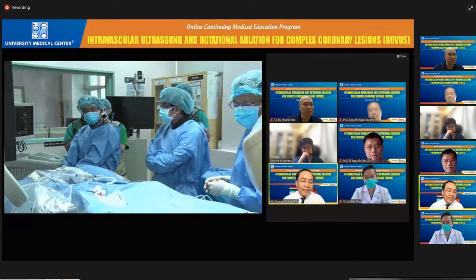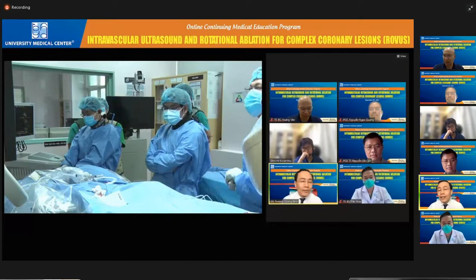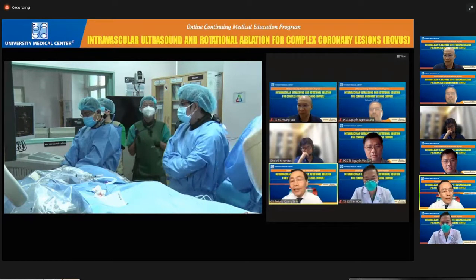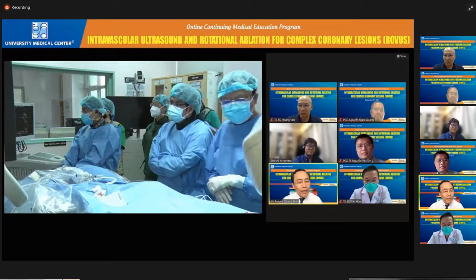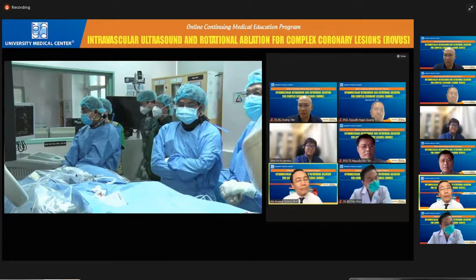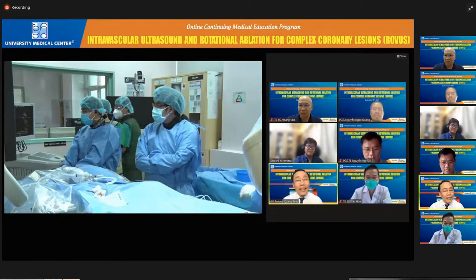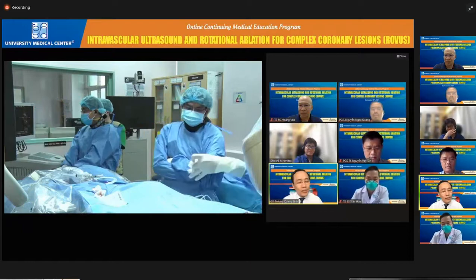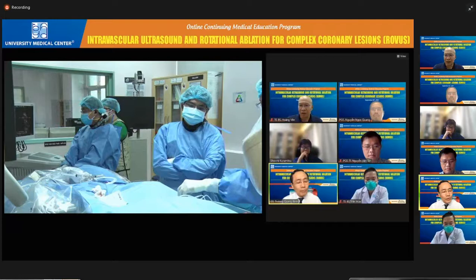Okay, very interesting question. How about the answer? Professor Nguyễn Ngọc Quang, we have one article published maybe 3 months ago about the EBC-MAIN trial. What do you think about this trial? How can we apply this result to this case?